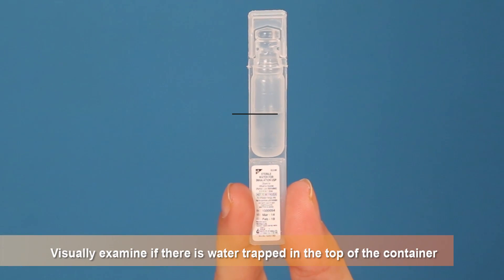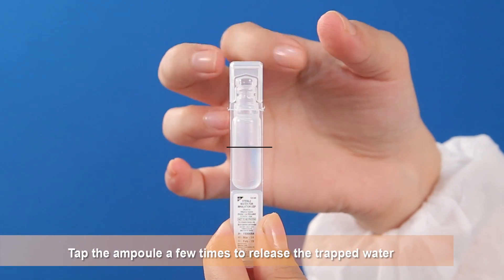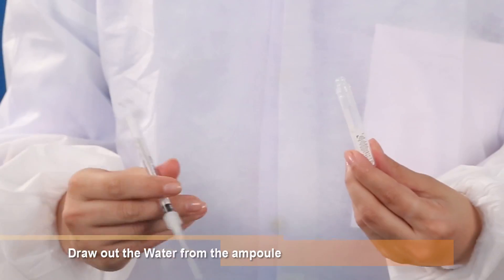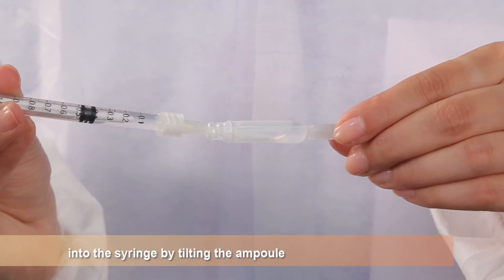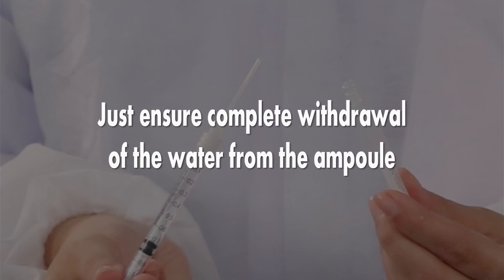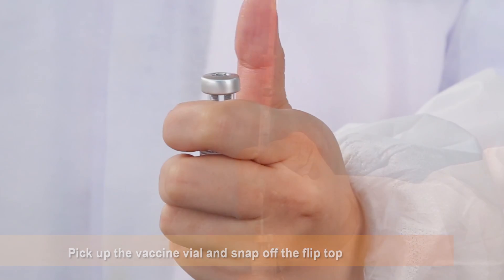Visually examine if there is water trapped in the top of the container. Tap the ampoule a few times to release the trapped water. Open the ampoule by twisting off the top. Draw out the water from the ampoule into the syringe by tilting the ampoule. It does not matter if there are any air bubbles in the water. Just ensure complete withdrawal of the water from the ampoule. Pick up the vaccine vial and snap off the flip top.